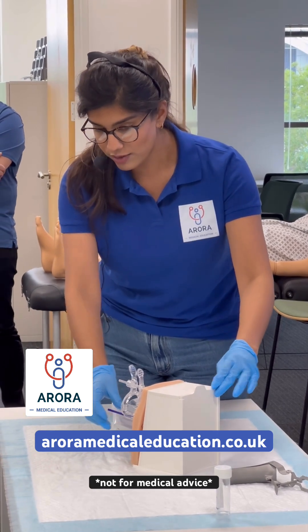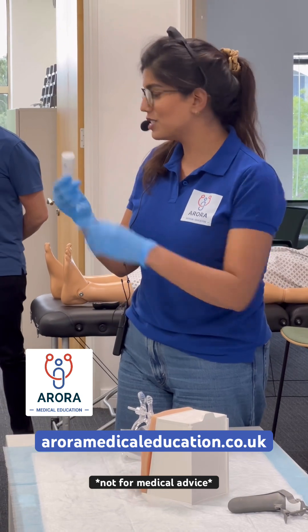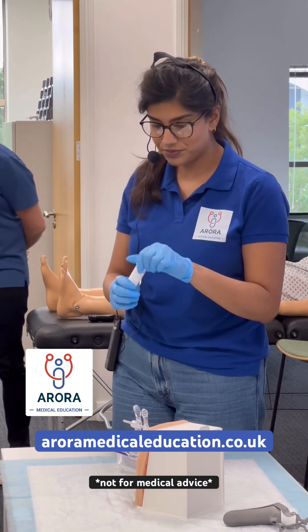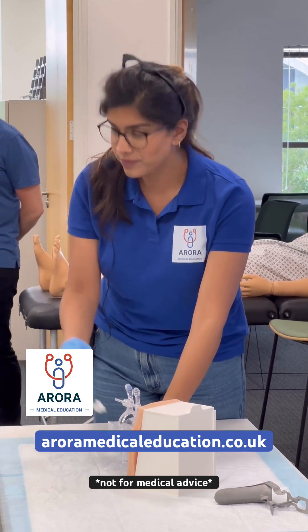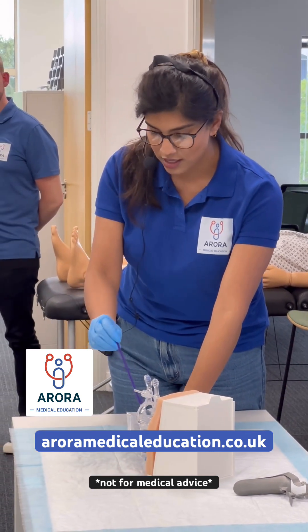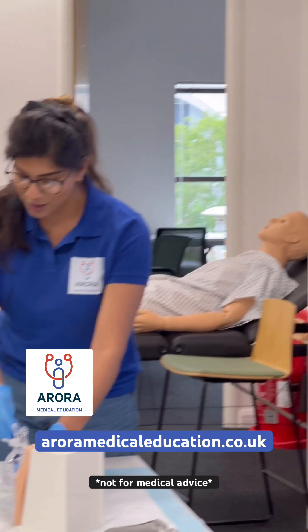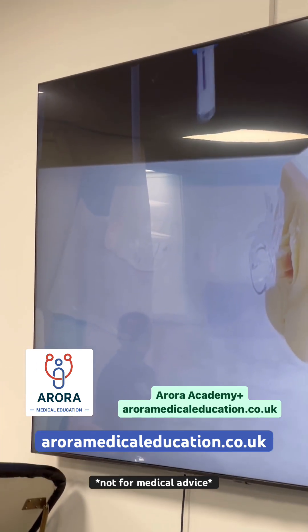So once you've done five full rotations, you'll have a liquid cytology vial. They all look a bit different — they tend to have liquid, and that's why it's important. Remove the smear brush and bash it as hard as you can, as many times as you can, into the liquid cytology vial.